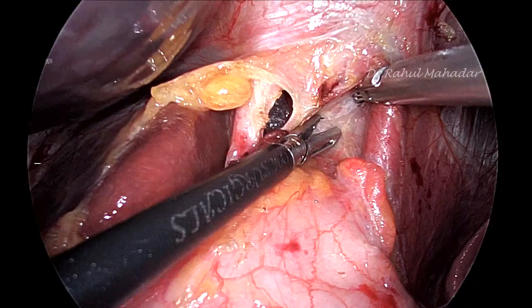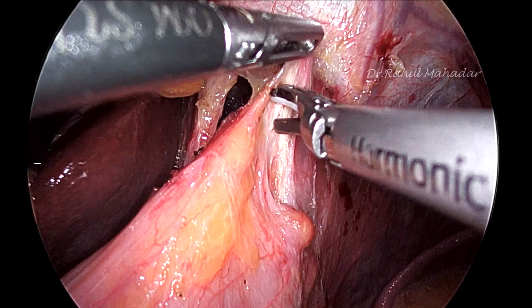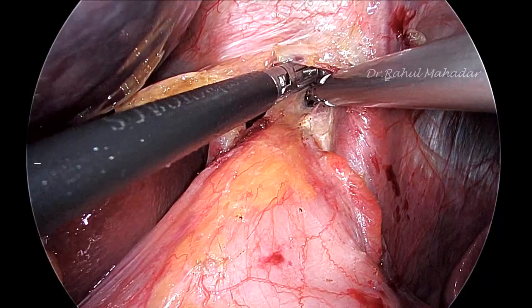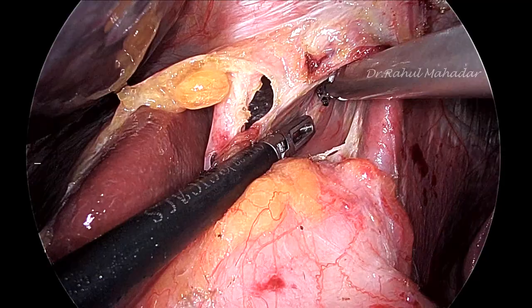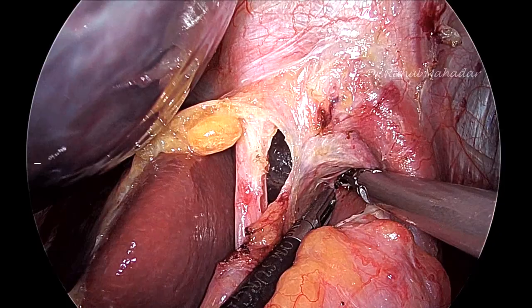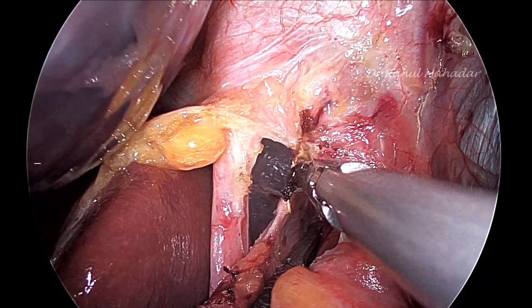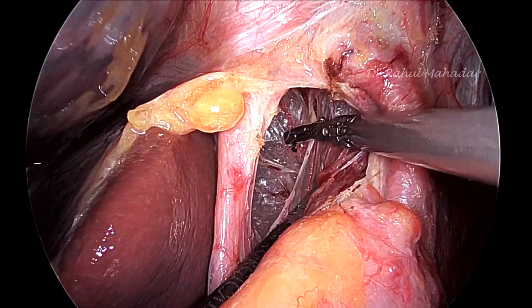With the left hand instrument, you can catch hold of this particular lining, and then you can cut with the help of the harmonic scalpel. Harmonic scalpel is quite handy for this particular operation. You can see here you are maintaining the lining over the left crus, and here you can see the anterior vagus, and you have to push down the vagus and then go into the plane above that.